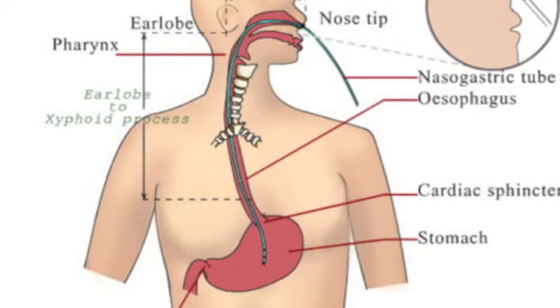Then you always end up with saline. Just like an IV: flush, med, and then flush again. With NG med instillation, and get in the habit with feedings also: flush, feeding, flush.